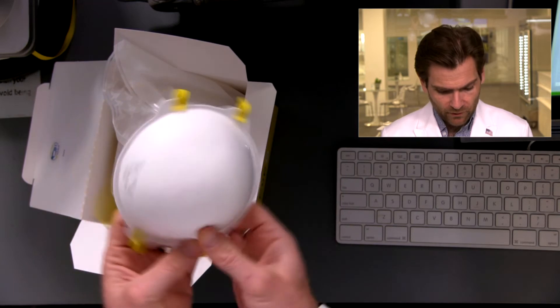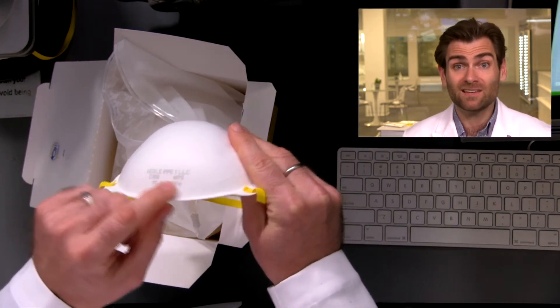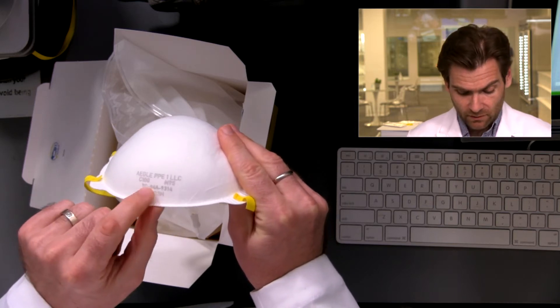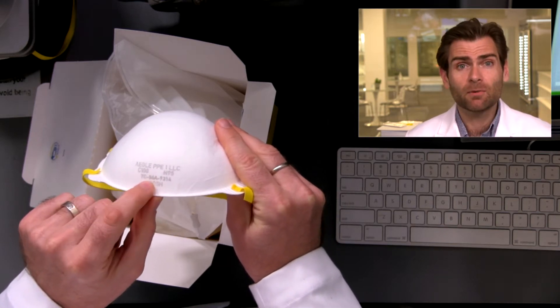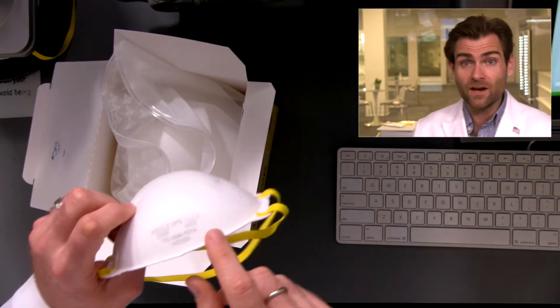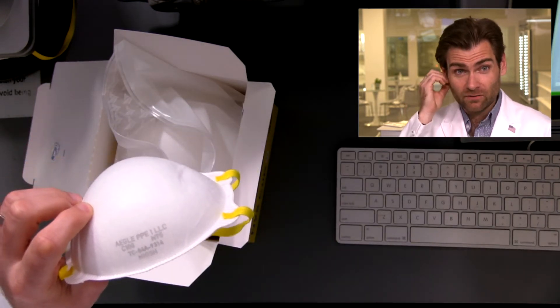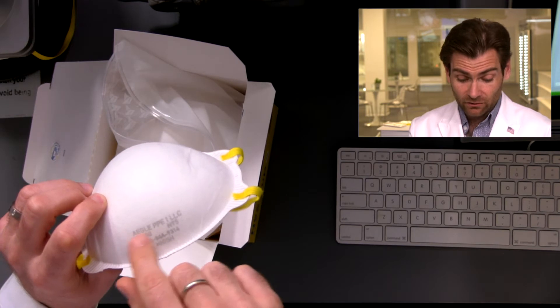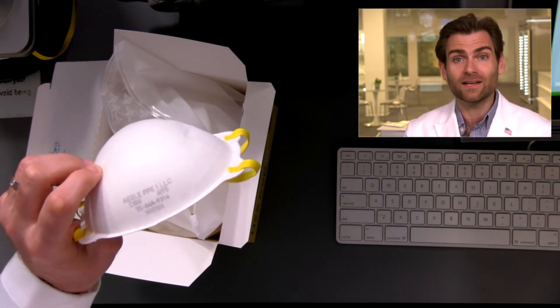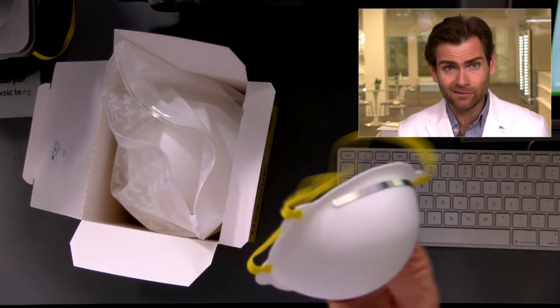Let's take a look at the mask itself. This is a cup respirator. One cool detail: a lot of manufacturers inkjet print the NIOSH number on these, which just doesn't look great. Aegle is using lasers — real lasers. It's like a $50,000 laser in their factory that literally burns their information right into the label. It doesn't affect mask performance, but it's a cool tech detail.